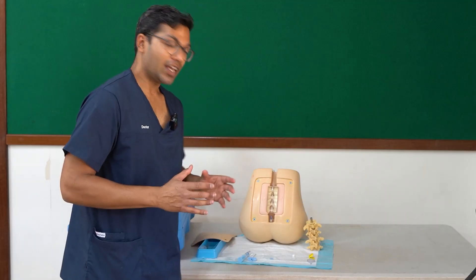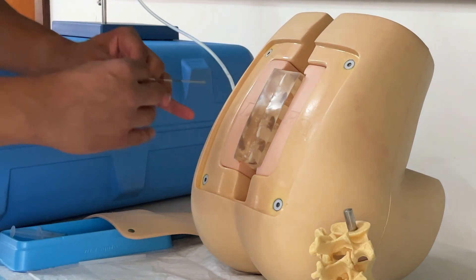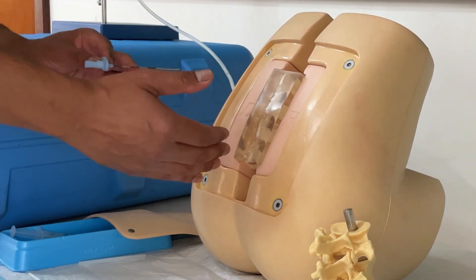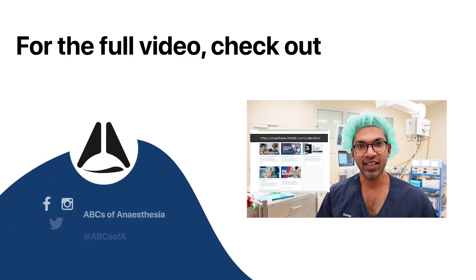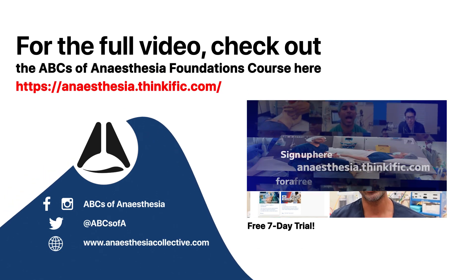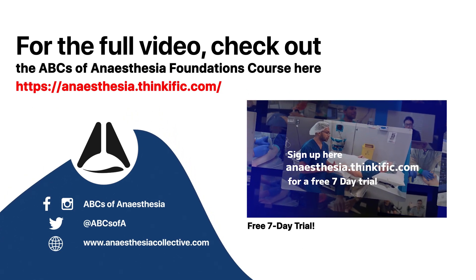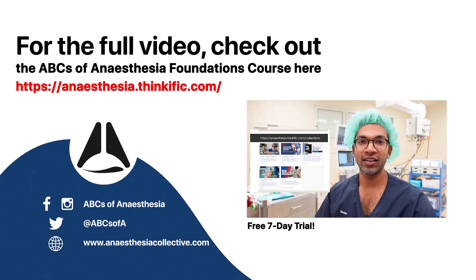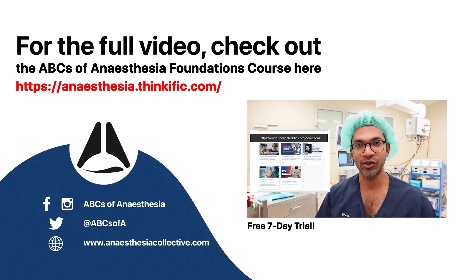I'm going to do this demonstration again but without the skin layers, so you can see exactly what's happening — imagine I put local anaesthetic into the skin and take that spot. ABCs of Anesthesia is also forming a whole bunch of very comprehensive courses for every stage of your anaesthetic journey, from medical student to procedural skills, foundations in anesthesia, as well as important exam lectures and clinical anesthesia courses.